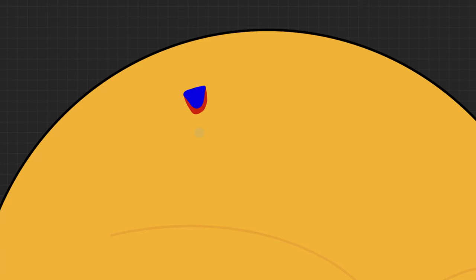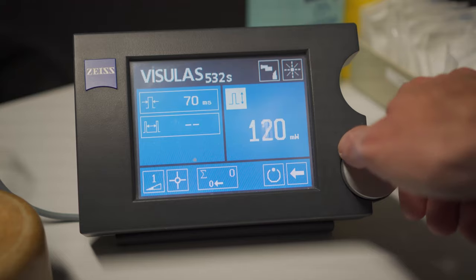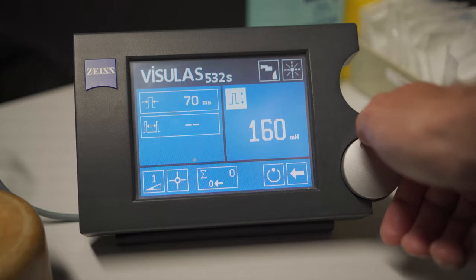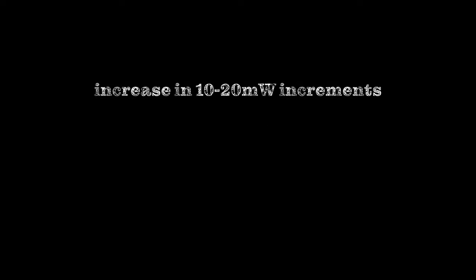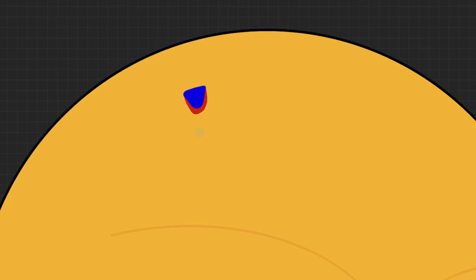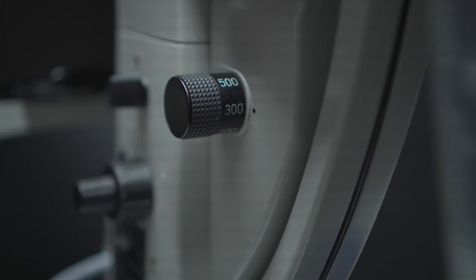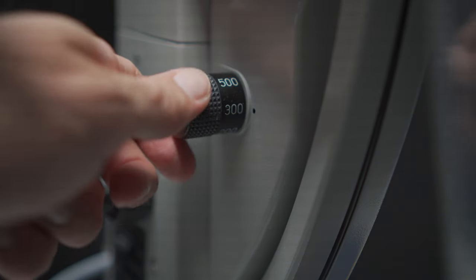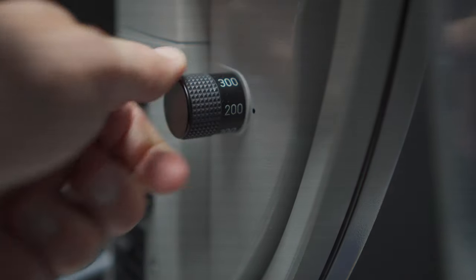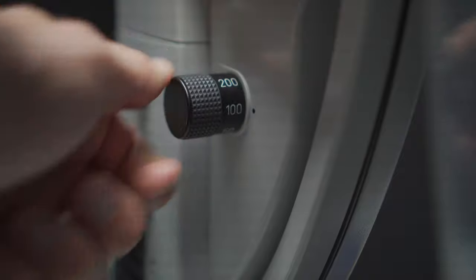If you're sure you're in the right focal plane but nothing happens, you can either increase the energy or decrease the spot size. To increase the energy, go in increments of about 10 to 20 milliwatts, and as a beginner, don't go any higher than 400 milliwatts. If you've increased the energy but nothing happens, try decreasing the spot size. I usually start at 300 microns and then go down to 200 or even 100.